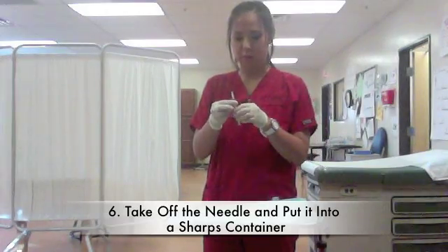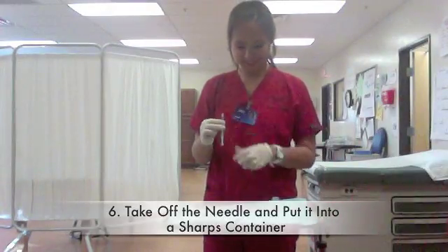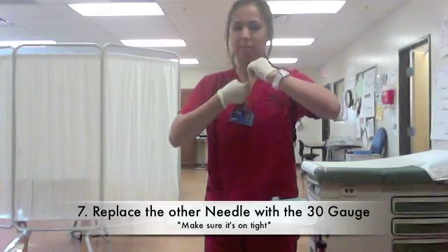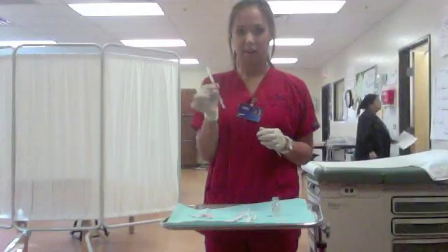The used needle goes into a sharps container. You get your 30-gauge needle and put that on. Make sure it's on tightly.